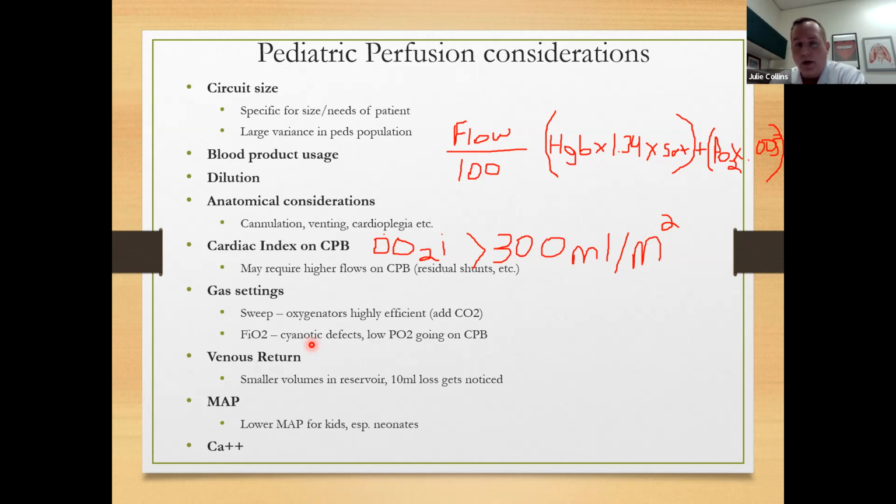So often, let's say we have a cardiac arrest in the unit and we've got to crash a kid on ECMO. I'm not turning my FiO2 up to 100% as soon as we go on. That would be pretty catastrophic. Your instinct is to say this kid has been without oxygen because they're doing CPR, get oxygen on, but physiologically that's often the wrong move.